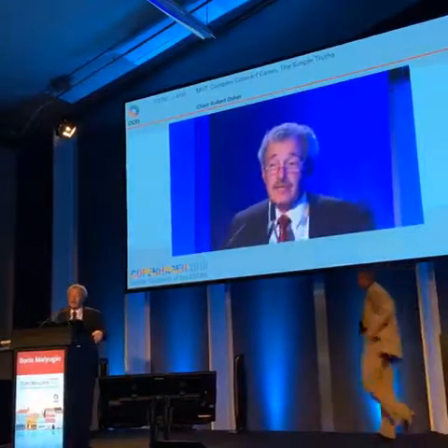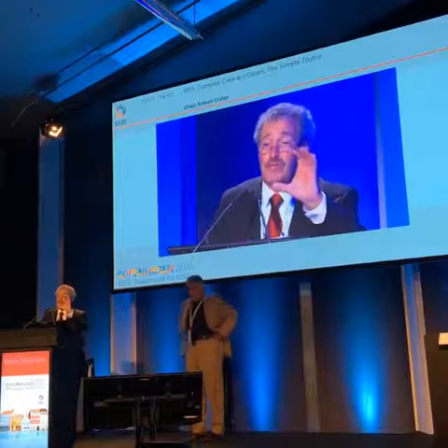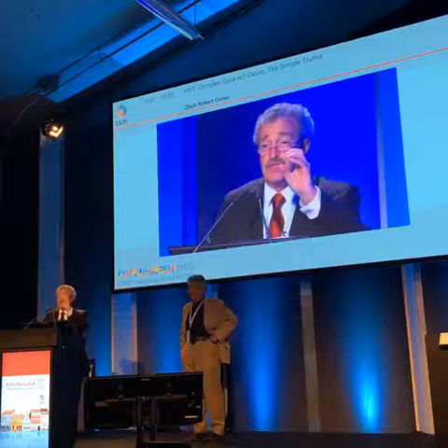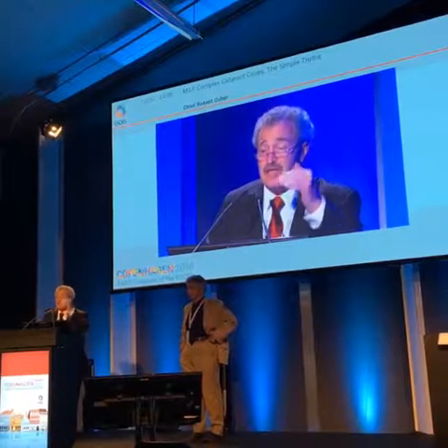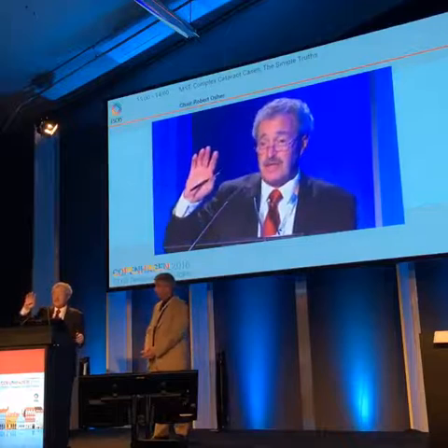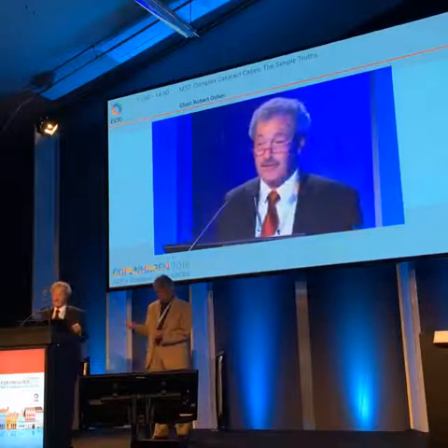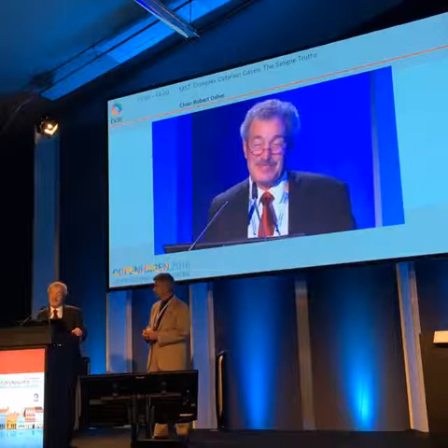Of a very timely, contemporary topic. I would caution you that if you're going to put a Malyugin ring in the middle of your case, because the pupil has constricted, it's very easy to inadvertently engage the anterior capsule. So you must be careful not to engage. Well, sorry about that. I didn't know Sam was going to talk about it. I usually try to give his talk for him.